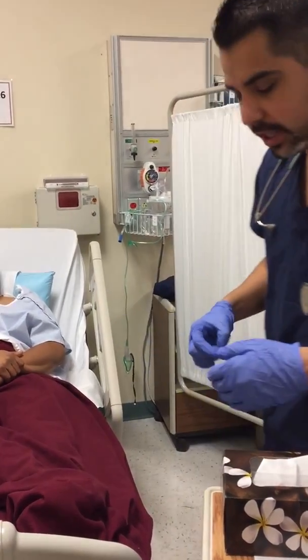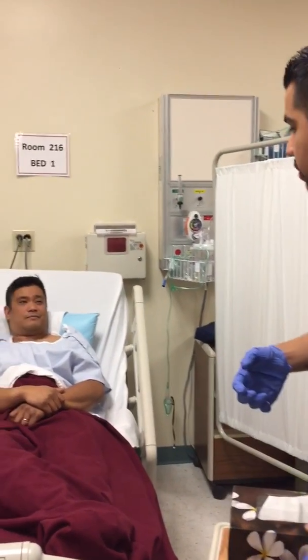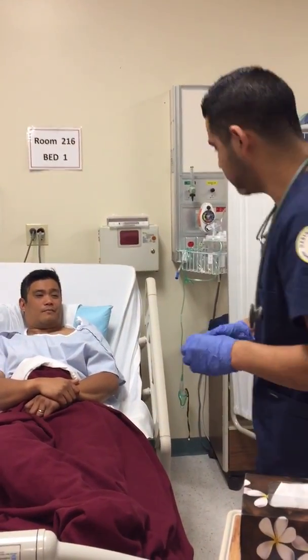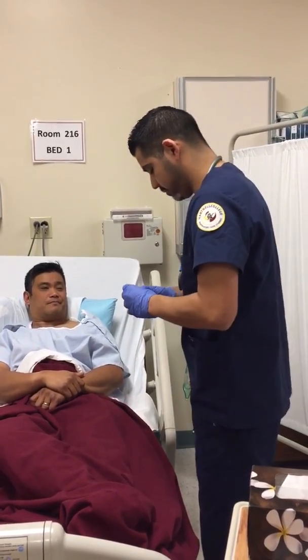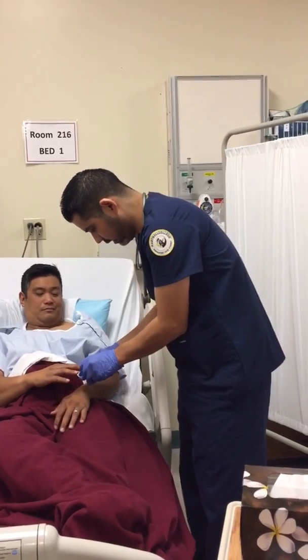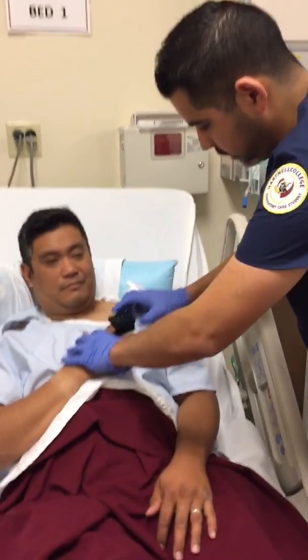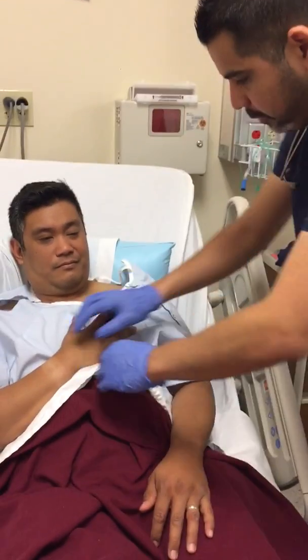Then we're gonna do some vital signs, and I'm gonna listen to your lungs before and after, and then I'm gonna do some blood pressure. Okay. All right. So are you sitting comfortable right there? May I see your finger, please? That's fine. Thank you. And I'm just gonna rest this across your chest. Let me check your pulse.